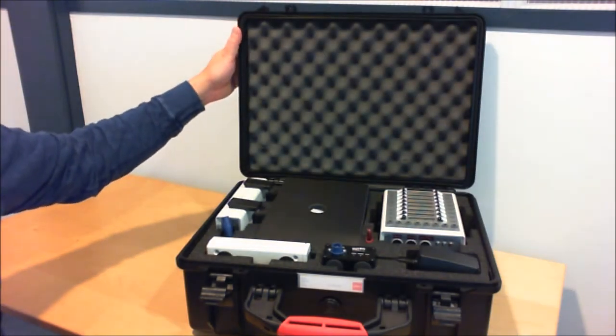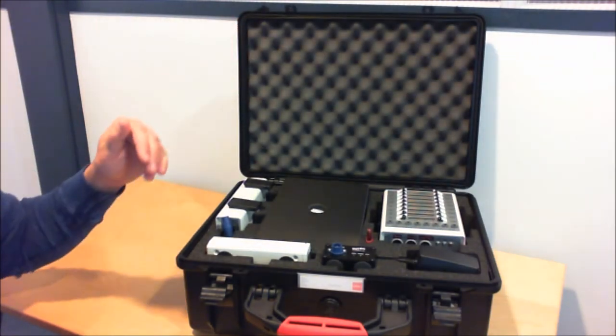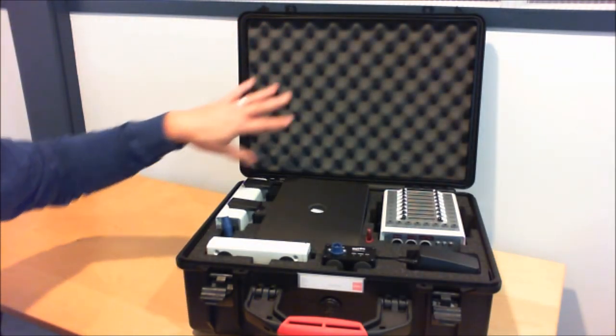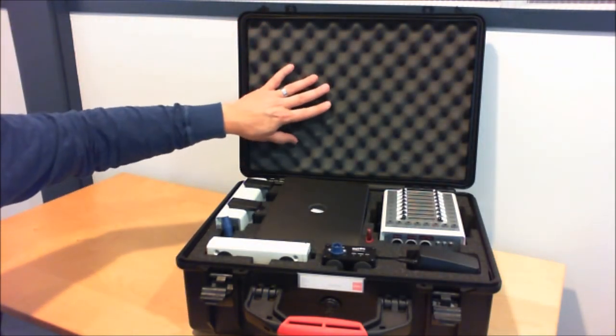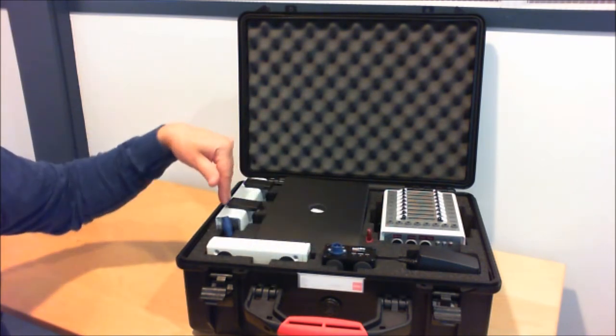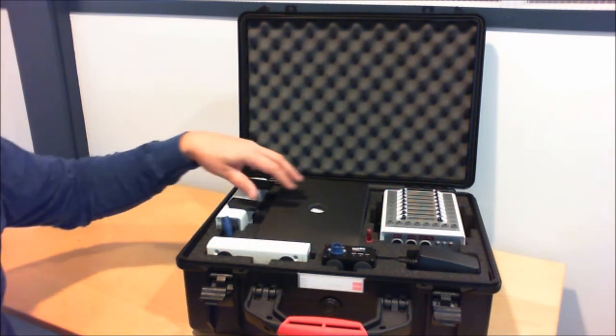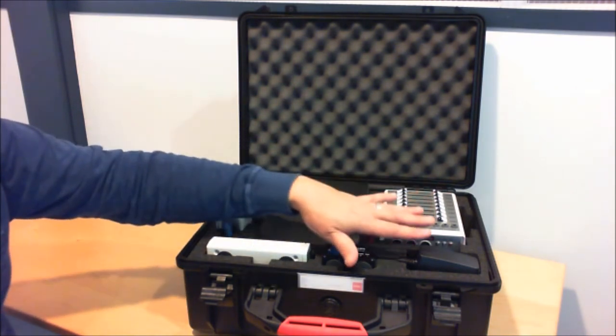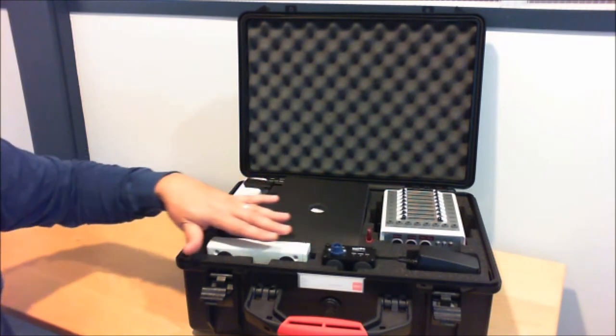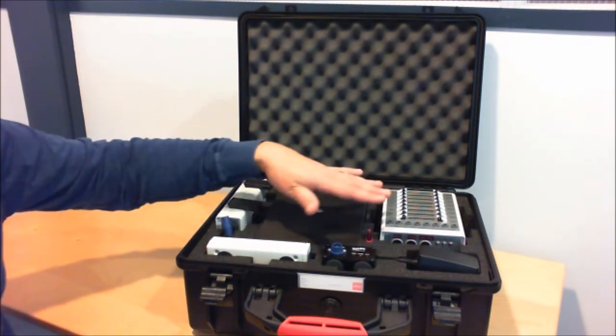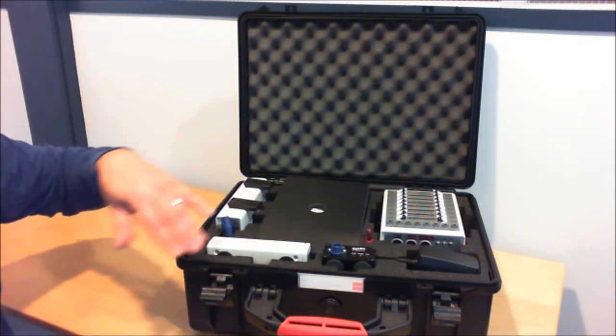The interior of the case is completely lined in foam. The top is corrugated and the bottom is a custom cut piece of foam. You'll see that each item that's part of the system has a place in the case.